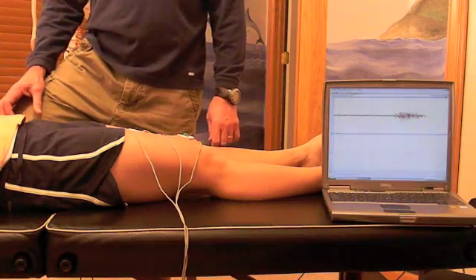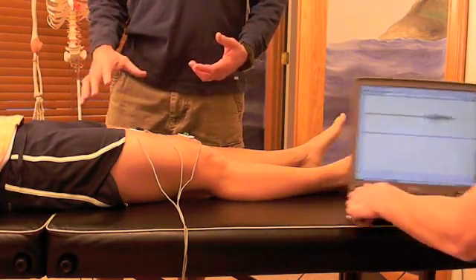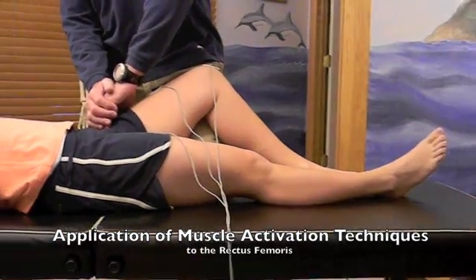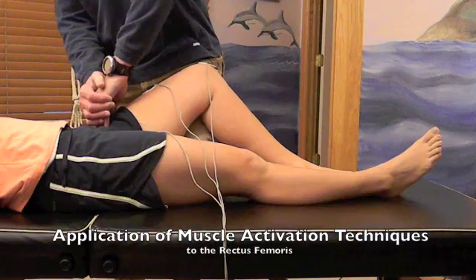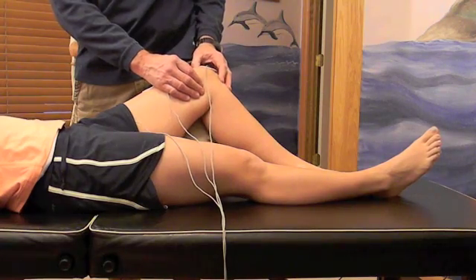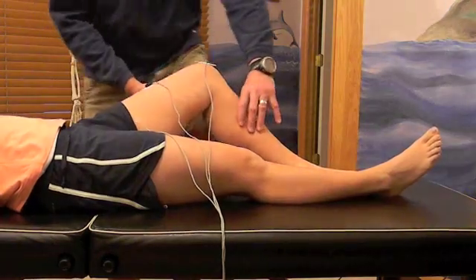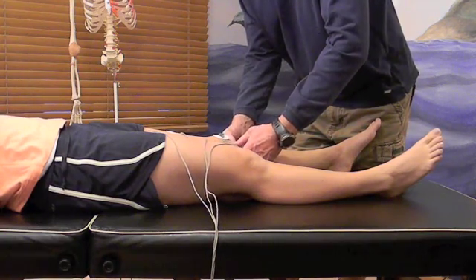Now we're going to do a muscle activation treatment on the rectus femoris. I'm going to go to the origin, just below the anterior superior iliac spine on the left side of her pelvis. Then we'll go to just superior of the patella on the patellar tendon before it integrates into the rectus femoris and the other three quadriceps. Then we go just below the knee on the top of the tibial tuberosity.